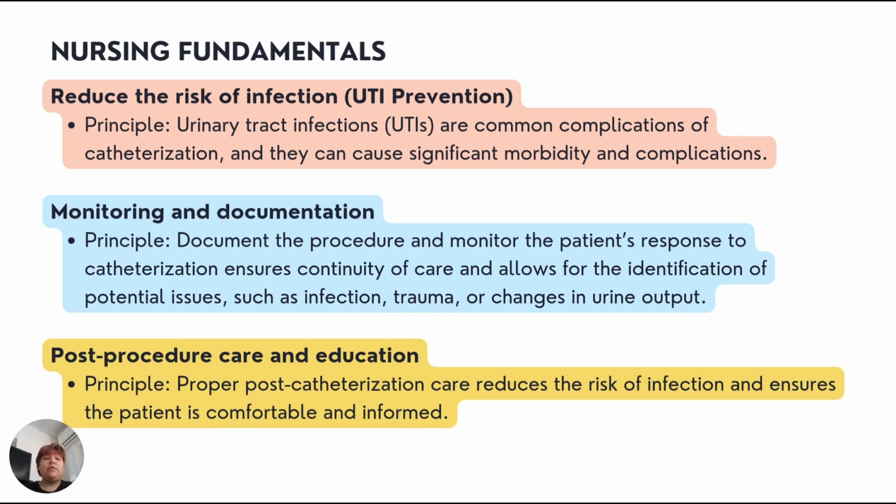Then we have monitoring and documentation. The principle here is that when we document the procedure and monitor the patient's response to catheterization, it ensures continuity of care and allows for the identification of potential issues, such as infection, trauma, or change in the urine output.